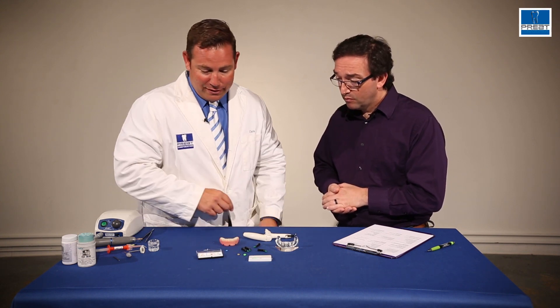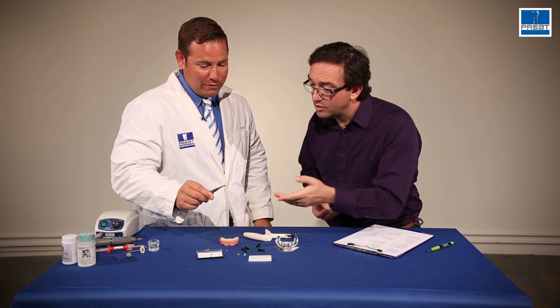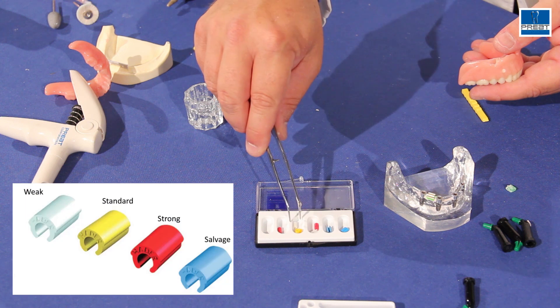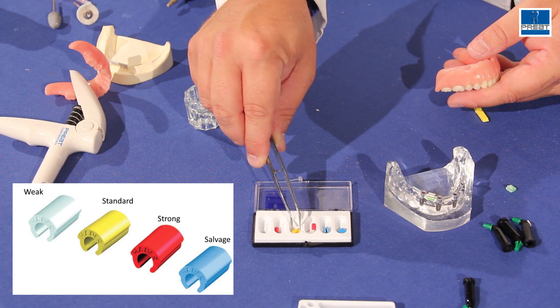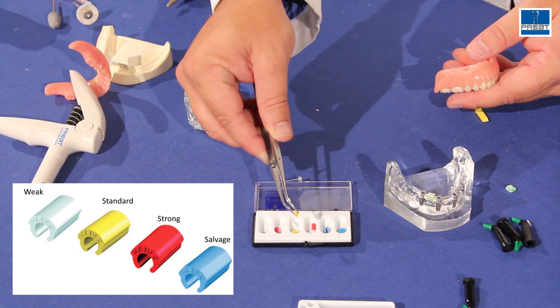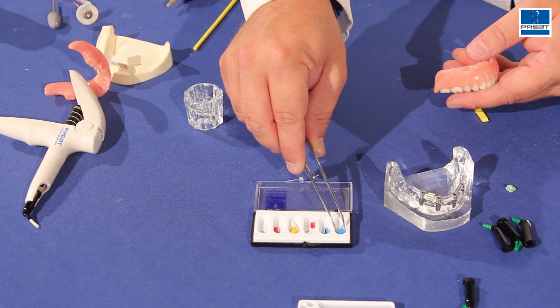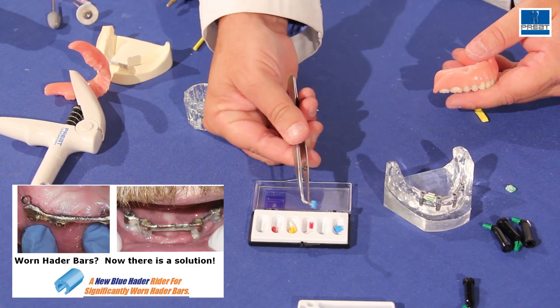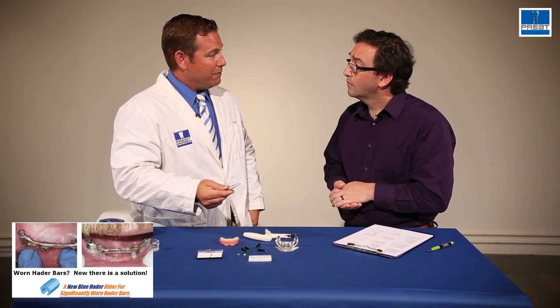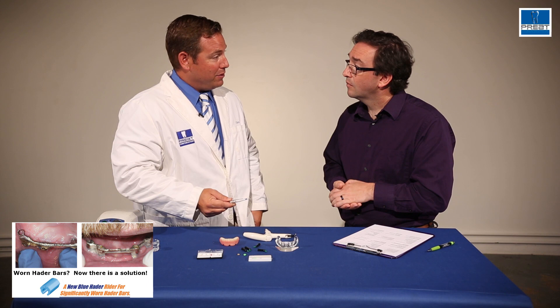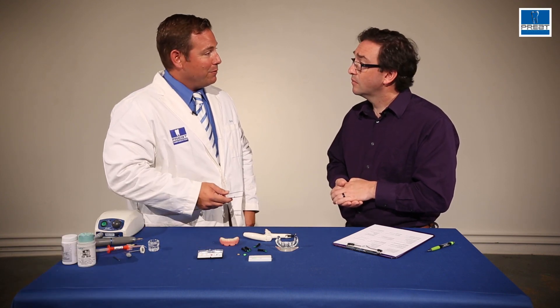And of course, we have multiple retentions of the Hader clips. What's the variation between these colors? The white is the weakest. Yellow is the standard, the most popular. If a patient wants more retention or if the retentive area of the bar starts to wear down, we have a red clip. And then the blue clip is designed with a smaller internal diameter, 1.5, to compensate for severe wear on the bar itself. So this way you would only use it as a salvage clip if the red was not providing retention.